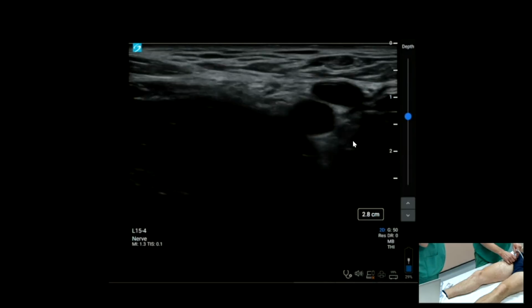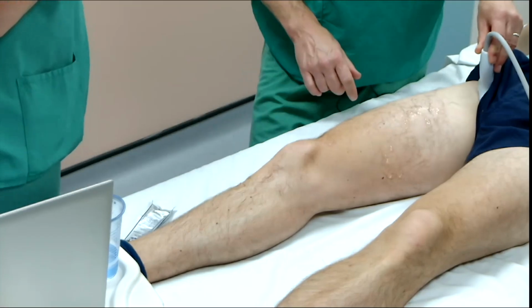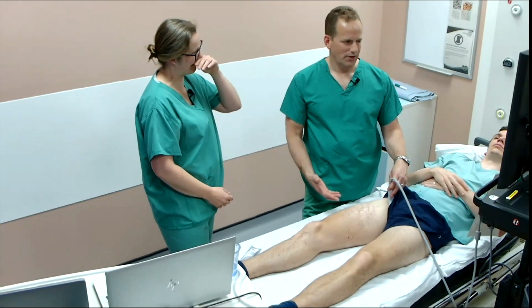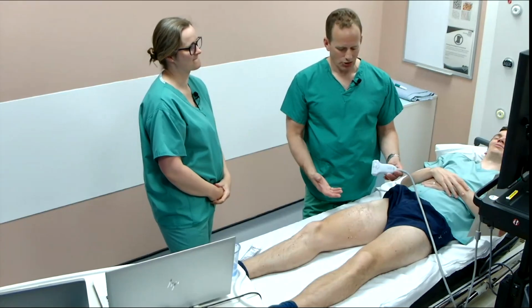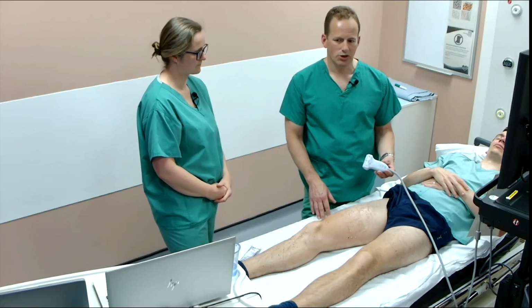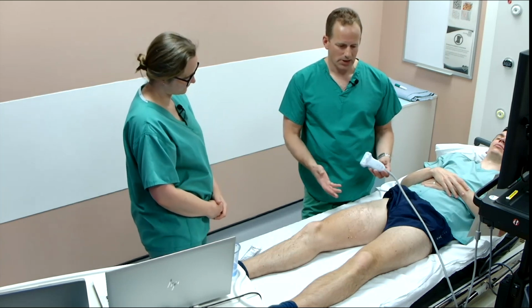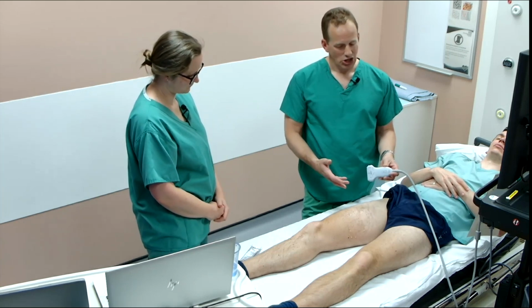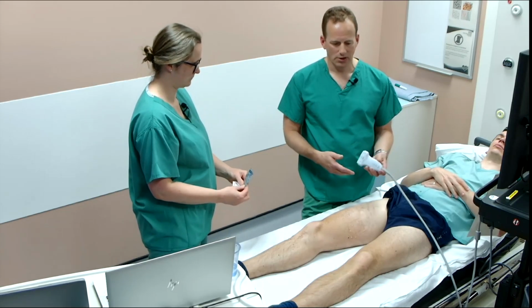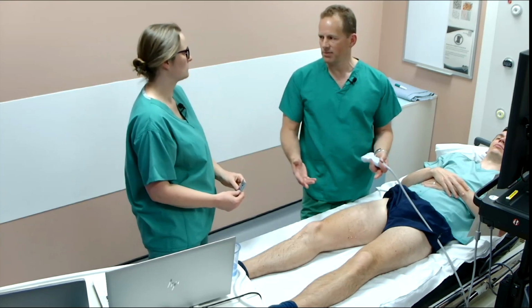Was there a particular patient you could think of as an example that would be a good patient for people to look out for? So some of our patients are quite challenging. In patients that are living with significant obesity, they're going to have very large legs, and so the femoral triangle block is going to be much deeper, and so we're going to struggle to necessarily get good views, and there are ways and means around that, but fundamentally sometimes you just run out of depth and the view is poor. But these have got to work, so there's no good doing a cross your fingers and hope block that is not going to provide any analgesia. You've done the patient a disservice.